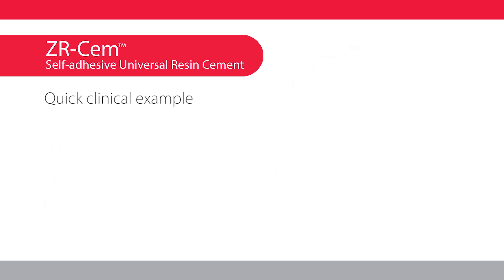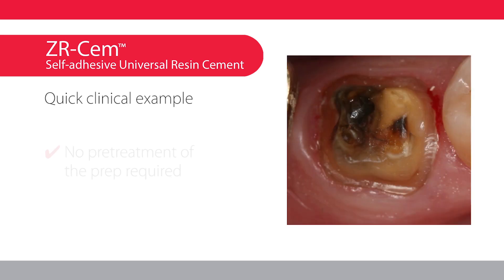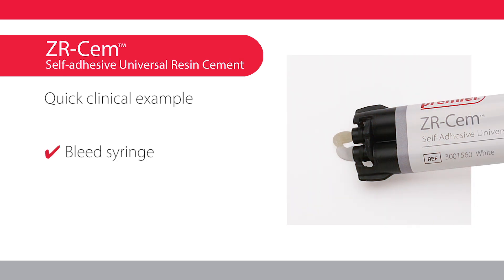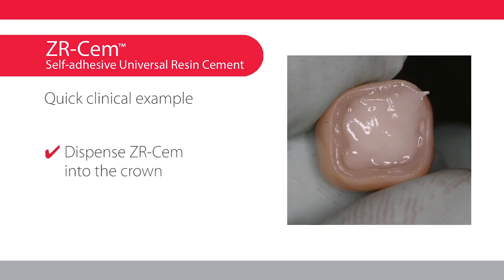Here's a quick clinical example. Rinse and dry the prepared tooth — do not desiccate. Bleed the syringe, then bleed the tip.